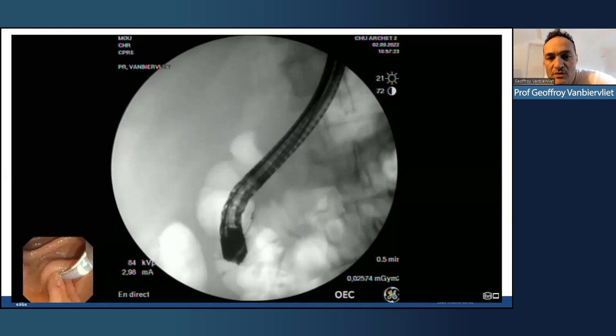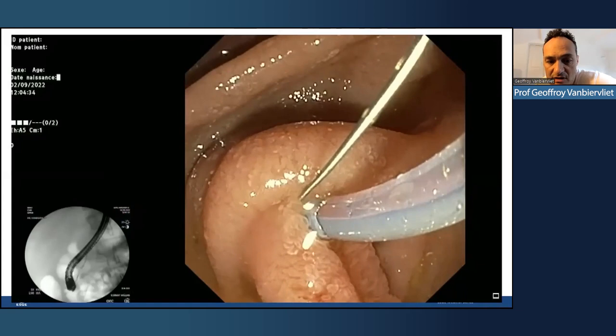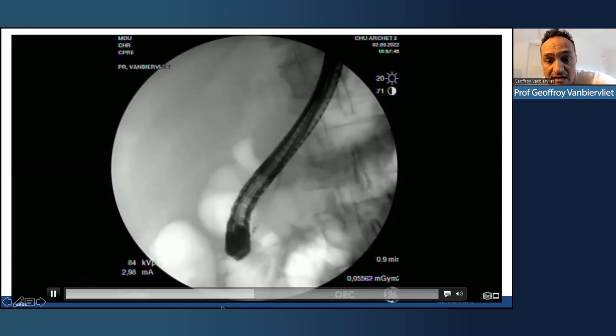Here you will see that during the second opacification we performed, we obtain the pancreatic duct. And in this condition, the second step is to introduce our guide wire in the pancreatic duct without any important opacification, to avoid the risk of acute pancreatitis. And when you introduce your guide wire, here it was the GPS wire from MedWork, when you introduce the guide wire inside the pancreatic duct, you can perform the double wire technique.